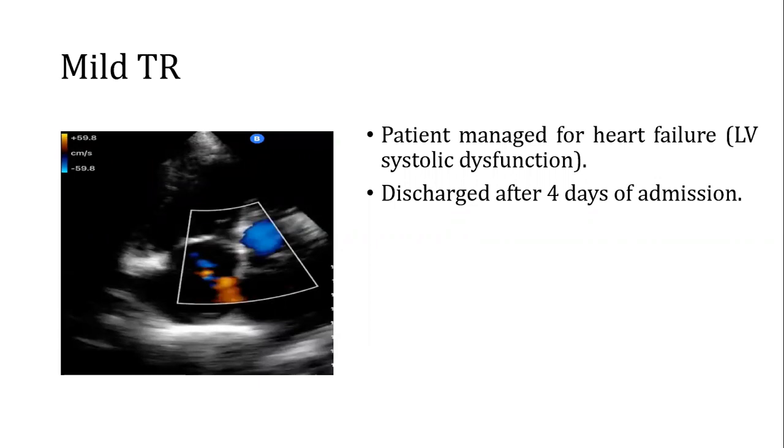So what am I trying to share here? How do we receive and triage our patients? We have seen from the first clinical diagnosis as asthma. 3 days later, the man is worsening. Chest X-ray done, interstitial pneumonitis, but the D-dimers are raised, so we opt for chest CT scan, which turns out to give us pulmonary edema and pleural effusion. No pulmonary embolism, thankfully. Otherwise, this patient would have died a long time ago.